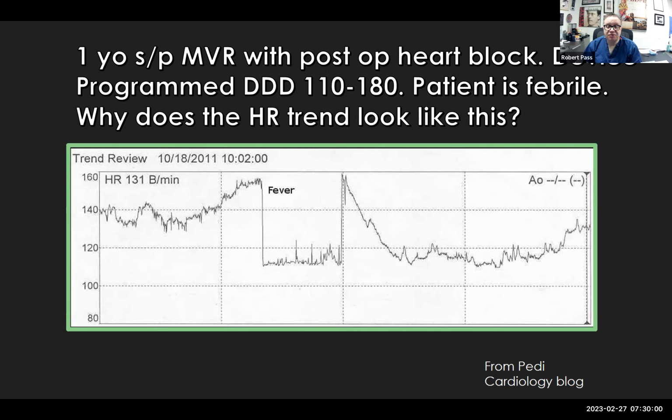But if the total atrial refractory period, which remember is the AV interval plus the PVARP, does not allow tracking to the upper rate limit, it won't track to that limit, even if you program it that way. So we have to be more sophisticated when programming permanent pacemakers. But at the bedside, because it's expected that an intensivist may not know all those fine details of programming, as you increase the upper tracking rate, the device will automatically shorten other intervals, not the AV interval but the PVARPs, to allow for continued tracking at faster rates. But that's what that is.